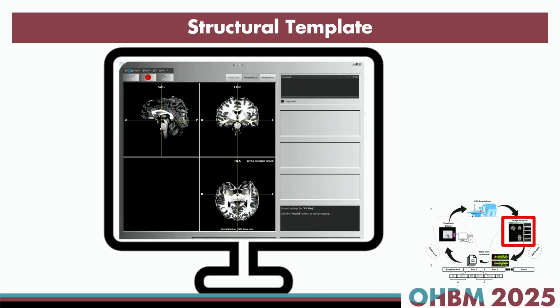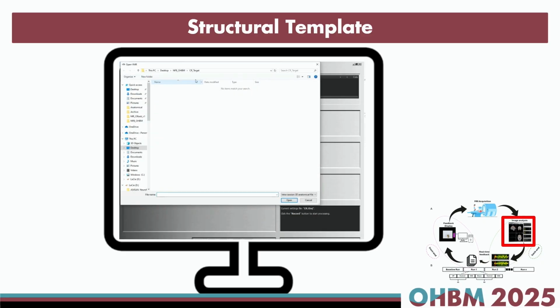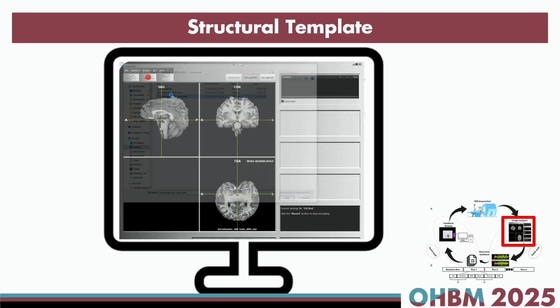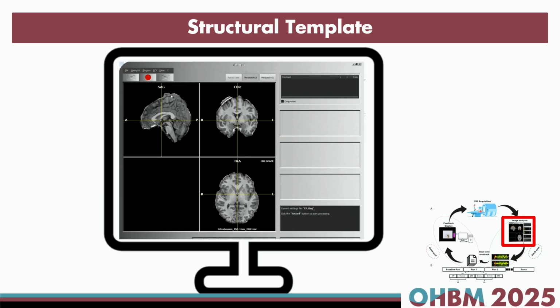As you can see here, the brain has been extracted, and the last step would be to generate the MNI template of the structural data, and all these steps will be followed in Turbo Brain Voyager through the menu. Again, for any details of these steps, keep in mind to use the documentation of Turbo Brain Voyager. And as you can see, this data is now MNI standard and ready to be used.